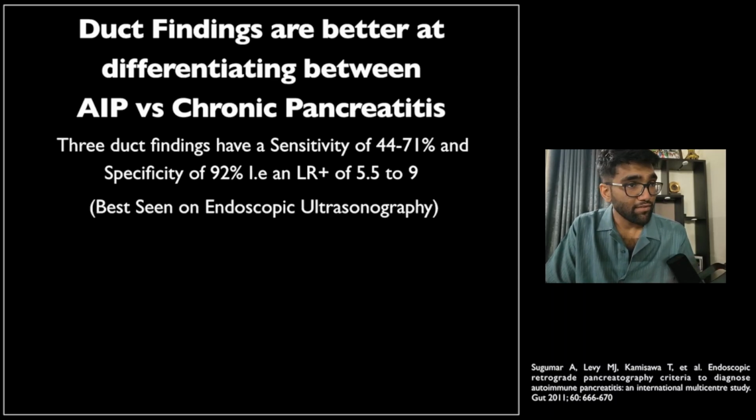Now, another caveat is that these findings have actually been described on endoscopic ultrasonography, which is obviously done by gastroenterologists. So the utility on routine conventional imaging is something that needs further appraisal, but because of the mechanistic overlap and the similar findings, there is a correlation.